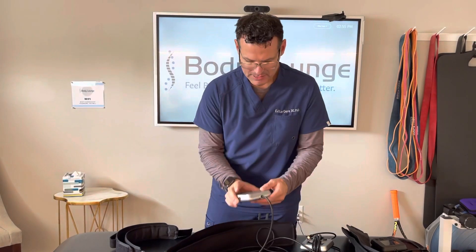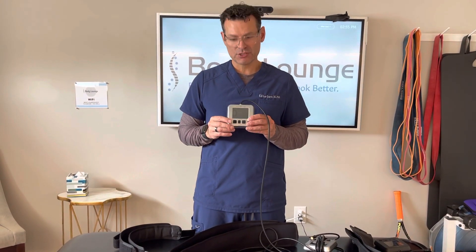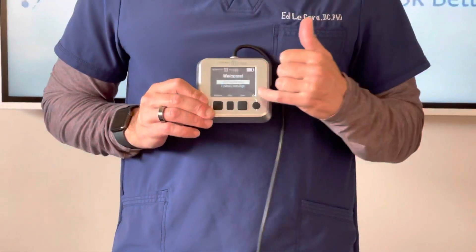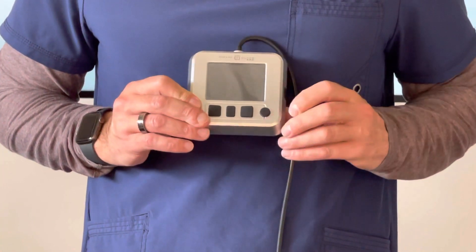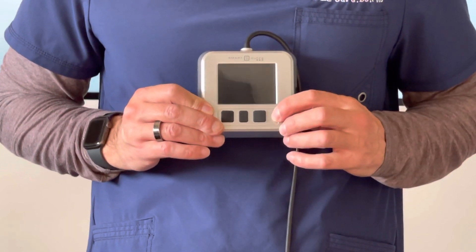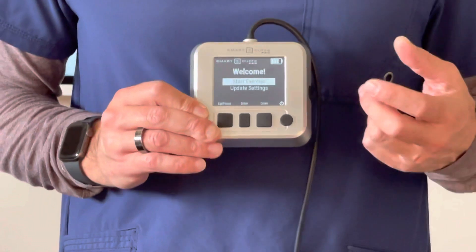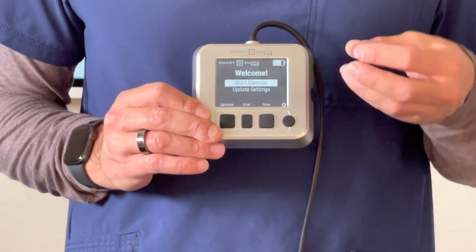So the next thing that I want you to do after this has been fully charged — charge it overnight. I'm going to turn it on. When you first turn it on, you're going to notice there's a firmware version underneath here. You always want to check and make sure that when you first receive the cuffs you're at the latest firmware.